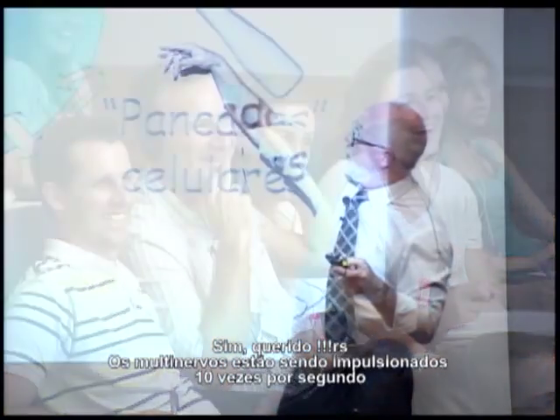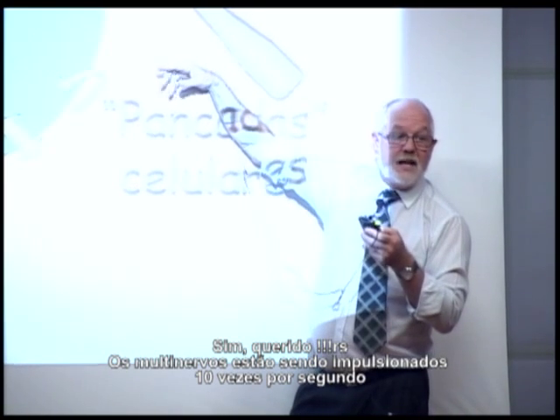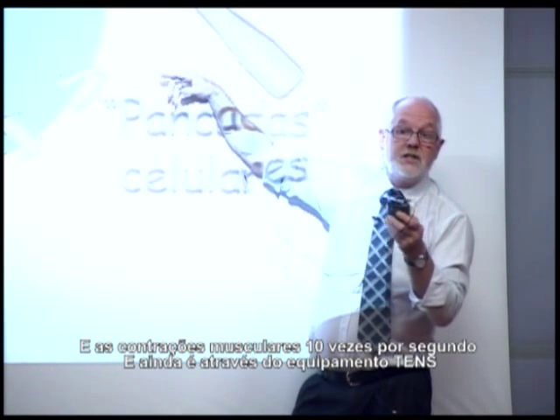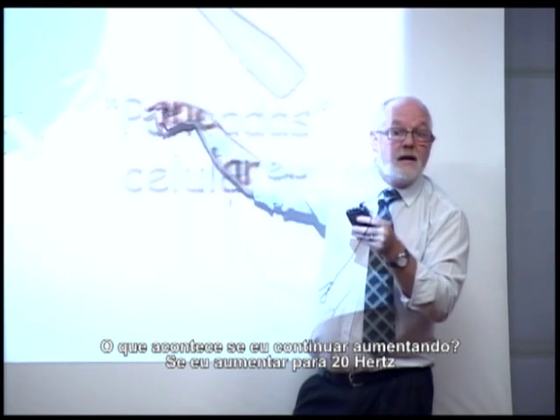You know? So if I go up to 10 hertz, 10 pulses per second, my motor nerve is firing 10 times a second, all right? And my muscle twitches 10 times a second. It's still a TENS machine. What happens if I keep going higher?